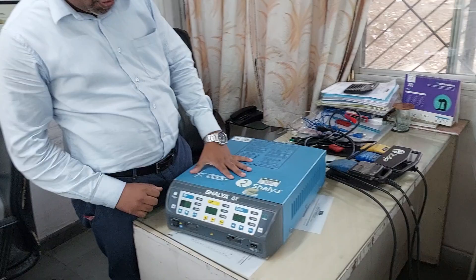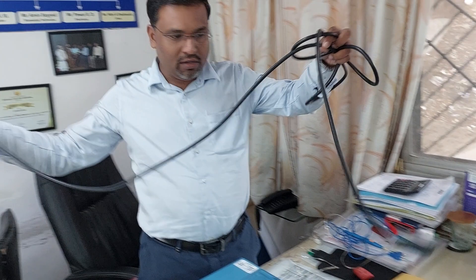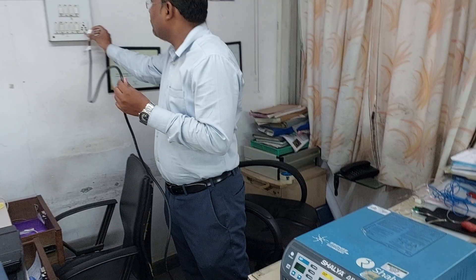You can see this is the Shalya AX cautery machine. First of all, look at the cautery properly. Second, you have to connect the power cord — this is the power cord provided with the cautery machine. At the back side there is a power plug; you just connect it.